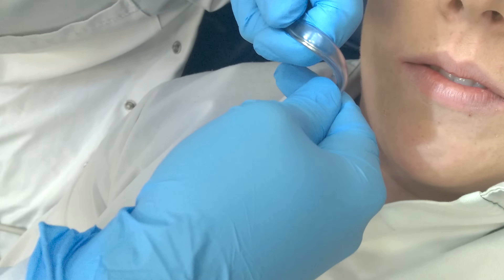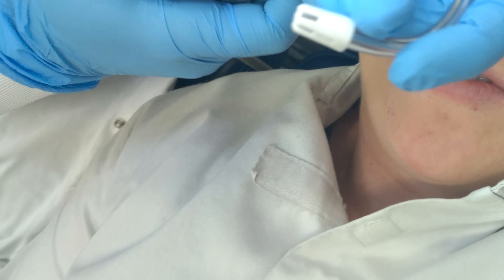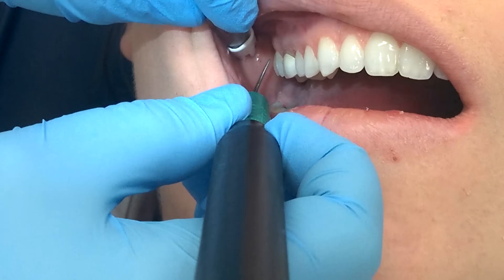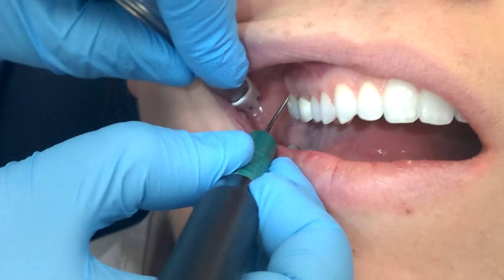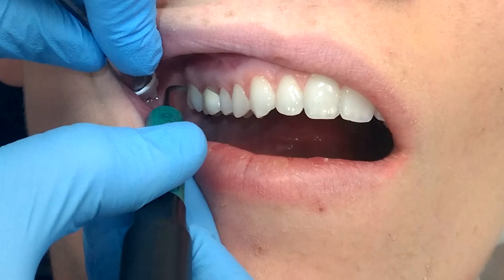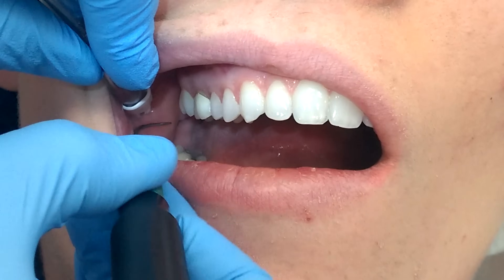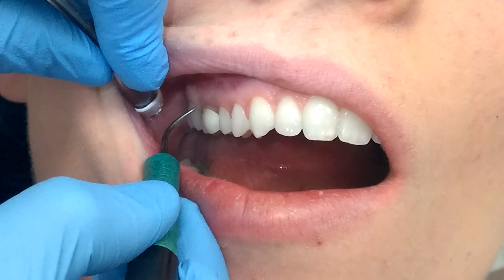Take the end and twist it like so, and then you can actually use the saliva ejector to retract as you go along. One technique you can use is to retract with your suction. I'm going to retract with my suction and use an extra-oral fulcrum, starting with a curette style and then adapting over to the facial using more of a probe style.